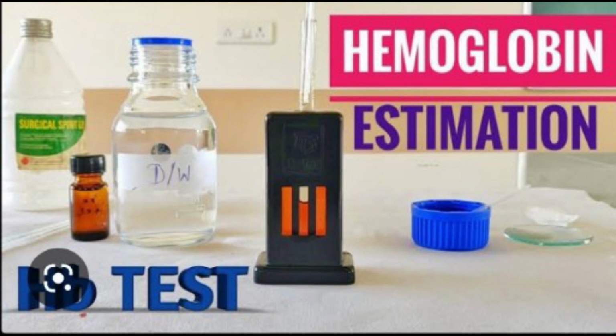Mix the contents of the tube and wait for 10 minutes. With the help of the blank and standard solution, find out the absorbance of the test solution in the colorimeter at 540 nanometer. Hemoglobin can be calculated as: hemoglobin equals absorbance of test solution times concentration of standard, divided by absorbance of standard.